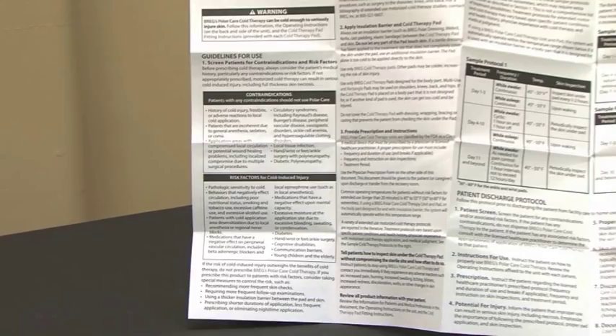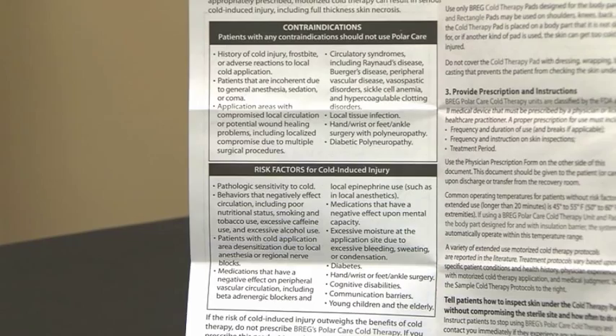Certain medical conditions make cold-induced injury more likely, so it's critical to carefully review and assess your patient with regard to each contraindication and risk factor noted on the product insert prior to applying the PolarCare system.